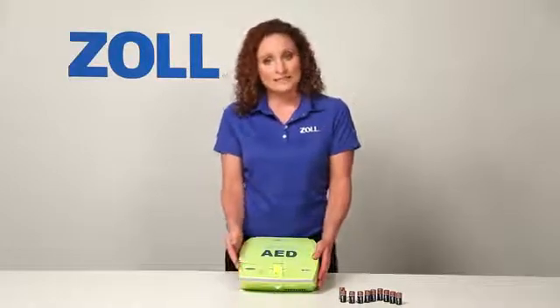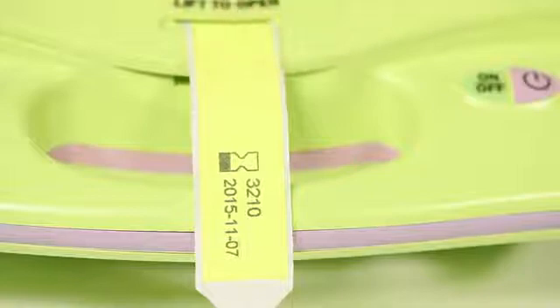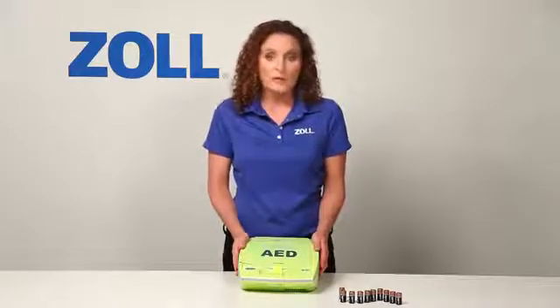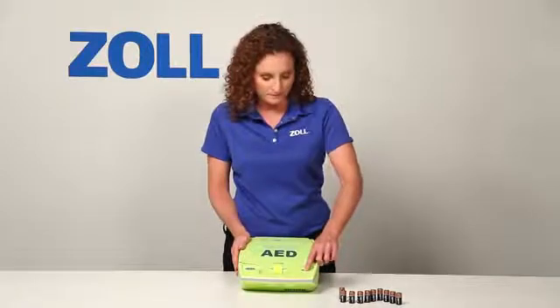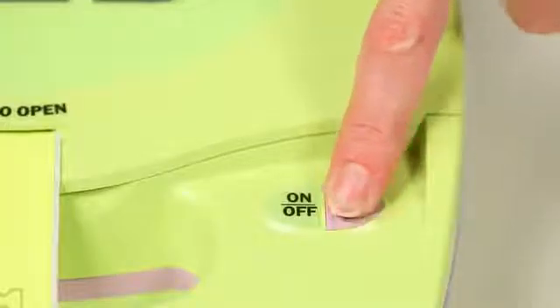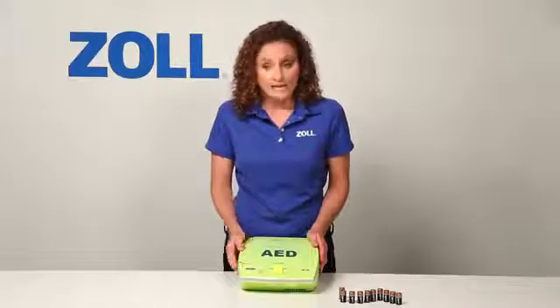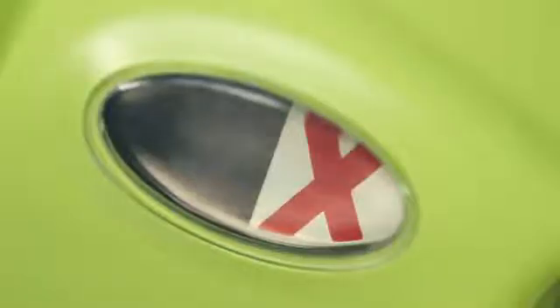Notice how easy it is to inspect the readiness of the AED. Check the expiration date of the pads by looking at the date printed on the tag that extends from the lid. You can conduct a self-test of all critical components by pushing the on-off button down and holding for 8 seconds. Unit OK. The AED Plus performs the same test automatically on a regular basis and presents a green check in this window if it passes, or a red X and a beeping alarm if it fails.